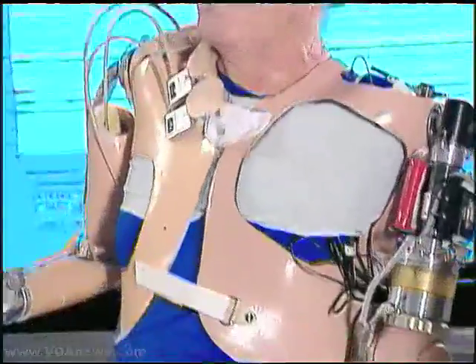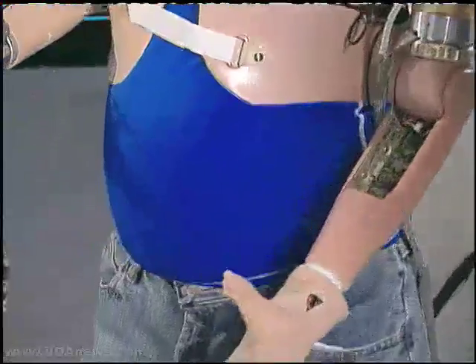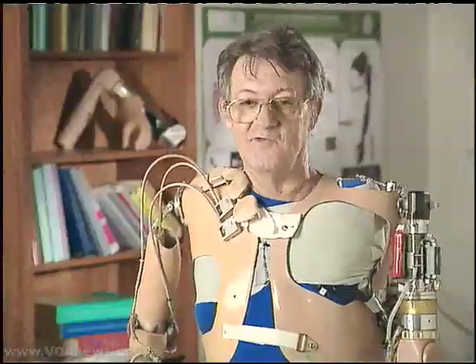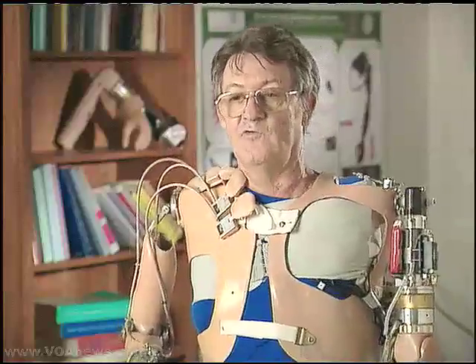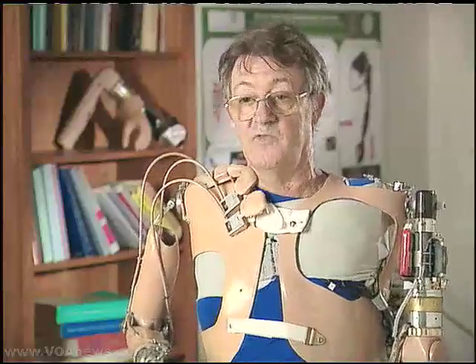Sullivan was the first patient to work with Dr. Kuiken's prosthesis. I was kind of scared a little bit because I didn't know what was going to happen, but I didn't have anything to lose — nothing to lose, everything to gain.